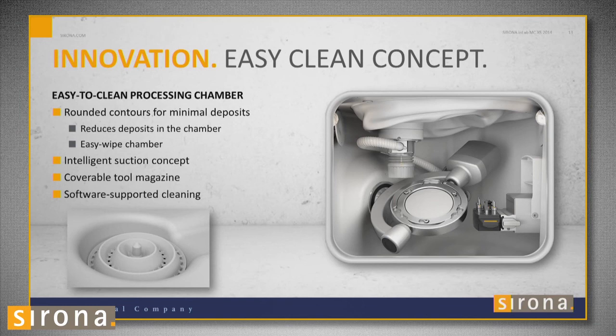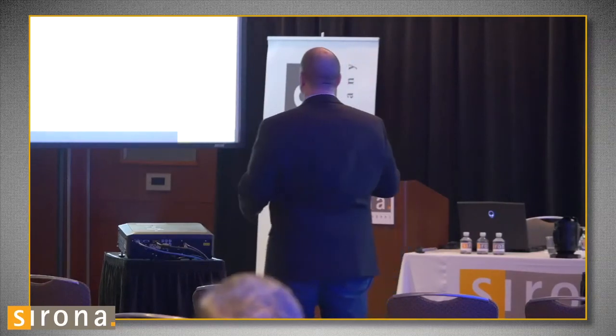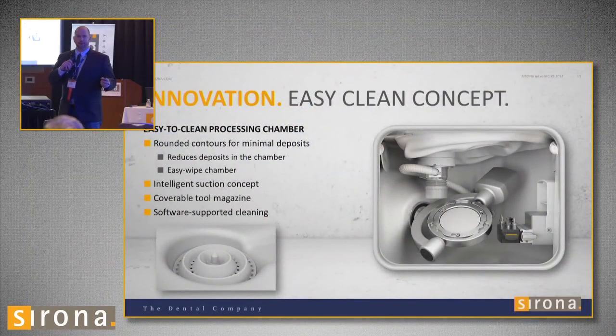The mill is very easy to clean. It comes with a suction unit. The suction only comes on during zirconia milling and turns on and off as needed — for example, it turns off during burr changes. After milling wax, I usually just take a paper towel, wipe out the inside, wipe off the disc holder, and then I can put a zirconia disc right in. No adjustments needed inside the machine. You don't have to make any changes to the chamber.